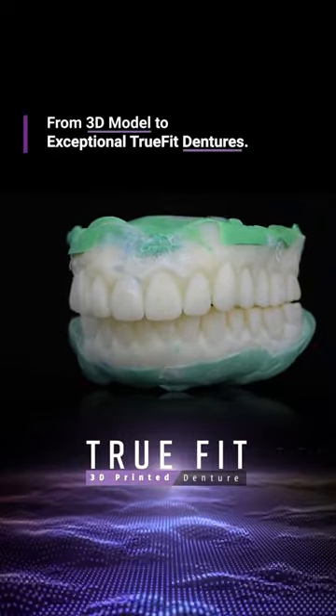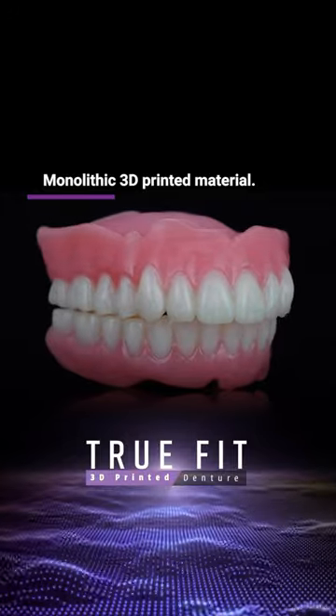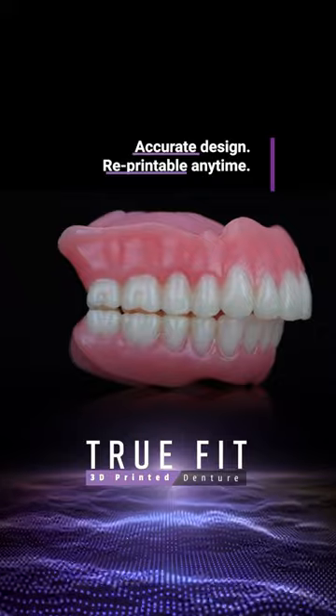TruFit dentures are crafted from monolithic 3D material. These dentures secure durability at a tailored fit, minimizing adjustments and maximizing patient comfort.